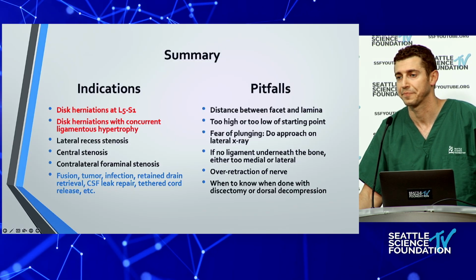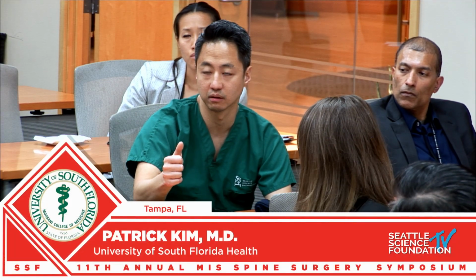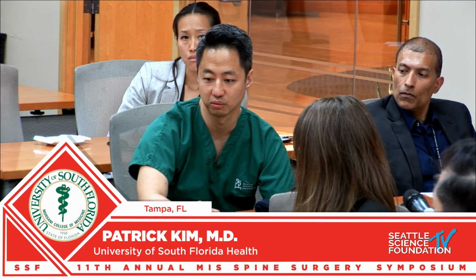Yeah, I agree with you. Especially if you have a durotomy and you occlude the channel, that's when intrathecal pressure goes up really high. And you have to get the case done as quickly as possible at that point.